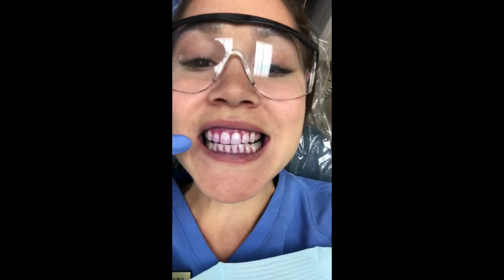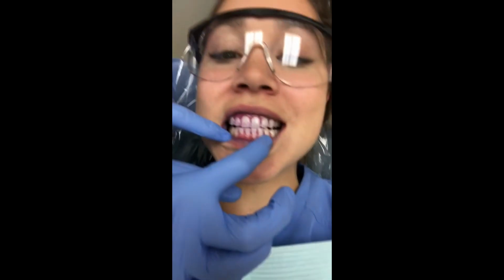And then you can see it's interproximal. Do you floss? No, I've never flossed in my life. So then you would just look and then you would record it.